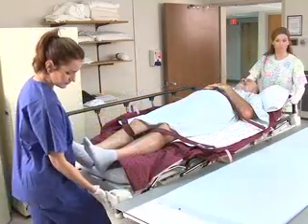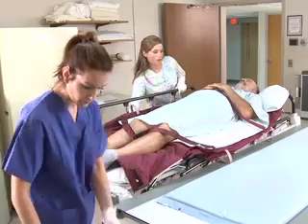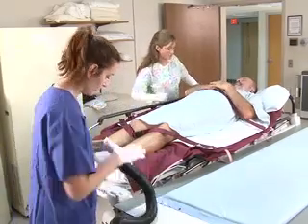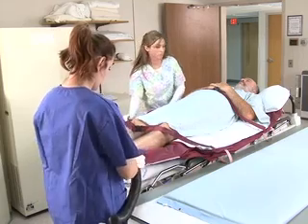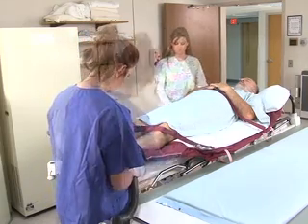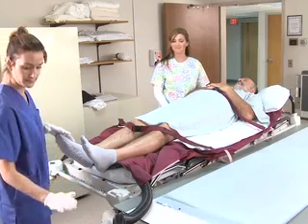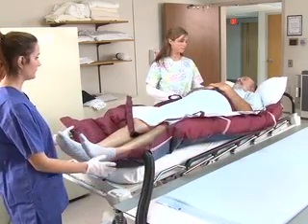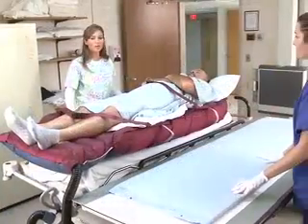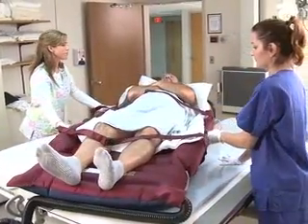Lock the wheels and lower the far stretcher rail, ensuring that the caregiver on that side remains close to the patient. Attach the air supply hose into the HoverMatt hose opening closest to the receiving surface. Inform the patient of the task. Assume the position of safety and instruct the other caregiver to turn on the air supply. Transfer your patient onto the imaging table using the stay close approach.